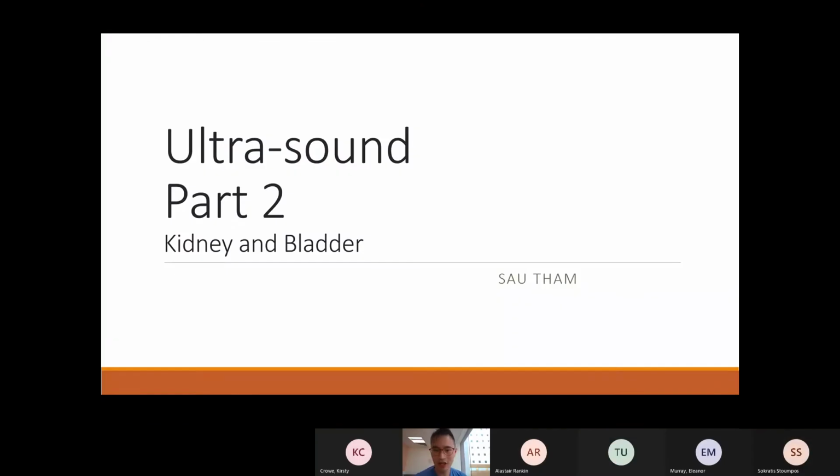Ultrasound lecture series. So we'll be focusing today mostly on kidney and bladder ultrasounding, and we'll be touching on concepts that we have touched on in the first lecture that I gave 2 weeks ago.